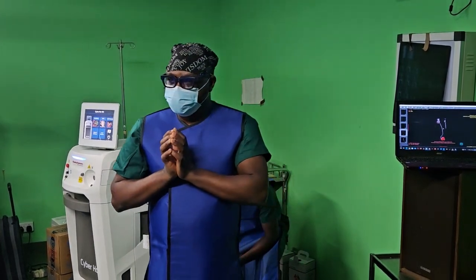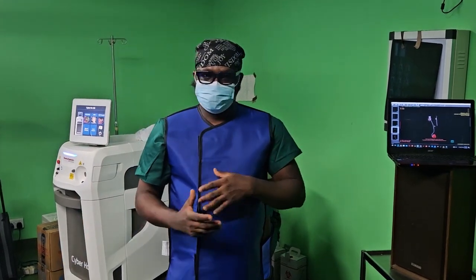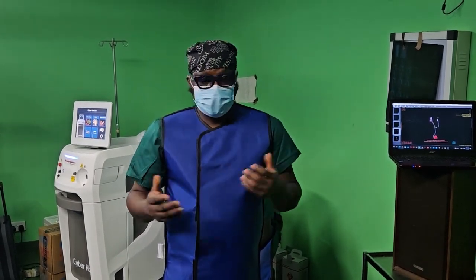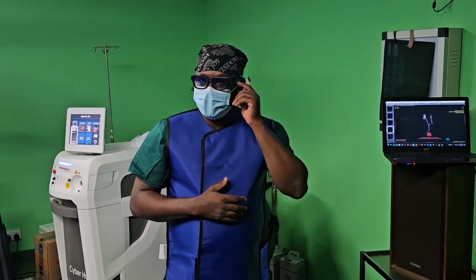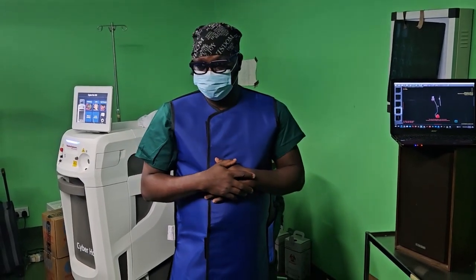Any disadvantage compared to the standard PCNL? The disadvantage is that you might spend a longer time. Because if you do the standard PCNL, you have a wider channel, you can easily use a lithoclast on bigger fragments, and then you finish the procedure quickly. But with advancements in high-powered laser and all this equipment, you can do quick work in mini PCNL too.